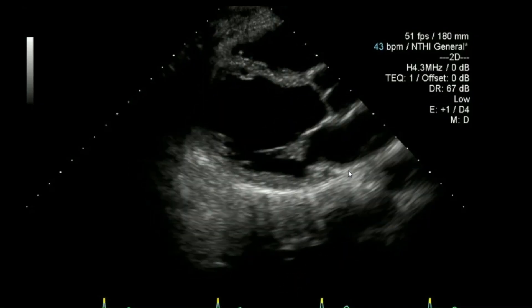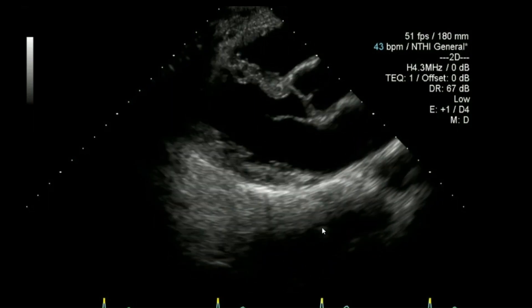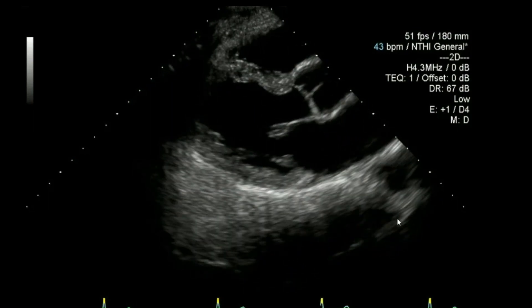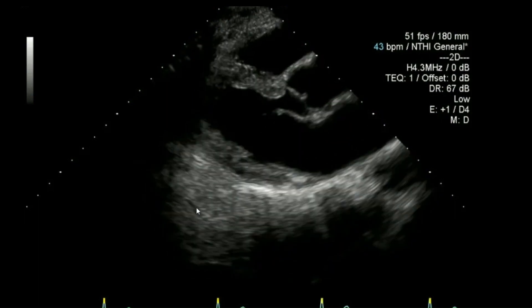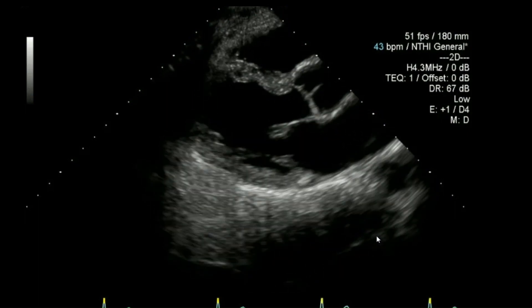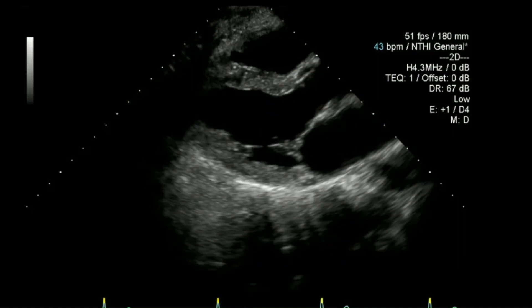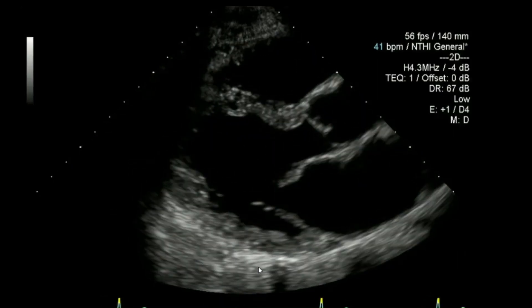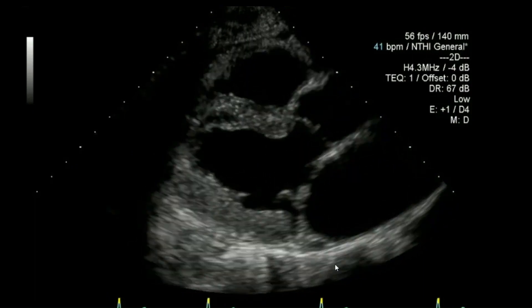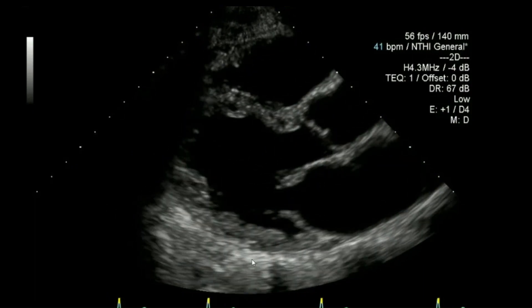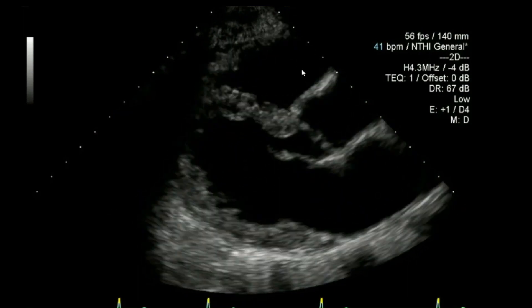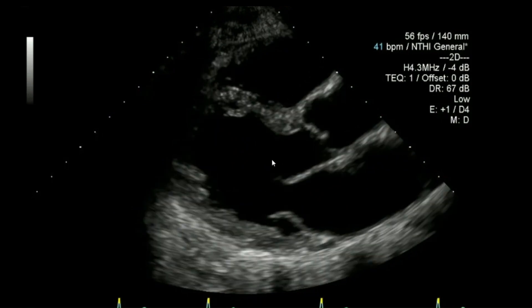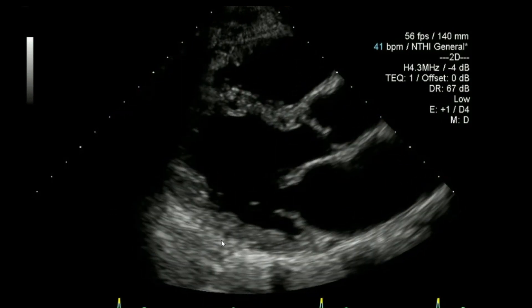Starting with the parasternal long axis view, I like to do a deep view initially so I can look behind the heart — looking for anything going on with the descending aorta, pleural effusions, pericardial effusions, or any extra-cardiac masses. From there I reduce the depth so I have about one to two centimetres behind the heart. I want black cavities, equal gain throughout the image, and to be somewhere between the papillary muscles.